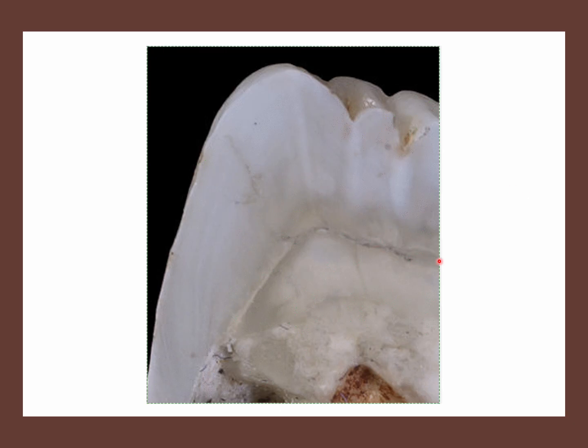Going back to this beautiful tooth, remember that we discussed the dentino-enamel junction, all the features that we can see on the dentino-enamel junction, all the features we can see in the bulk of the enamel, the striations, and now we are going to talk about the enamel surface. The enamel surface and where the enamel actually meets the cementum.